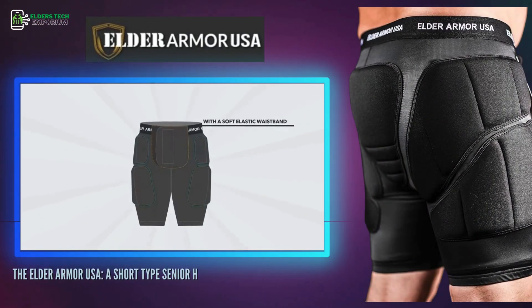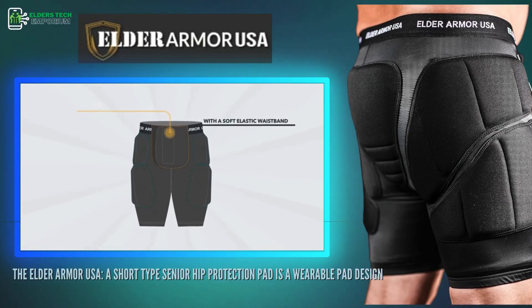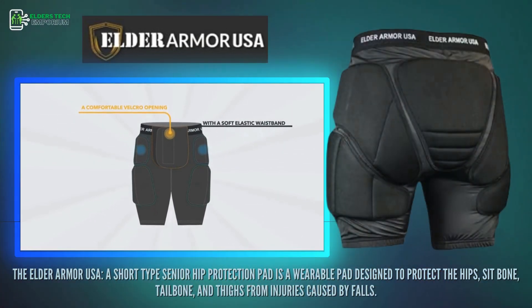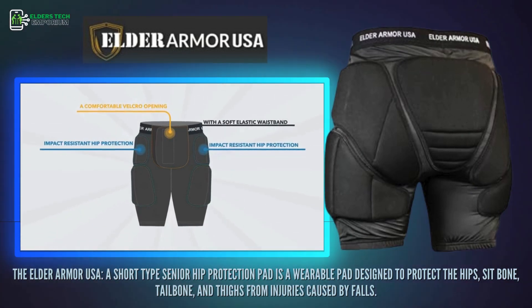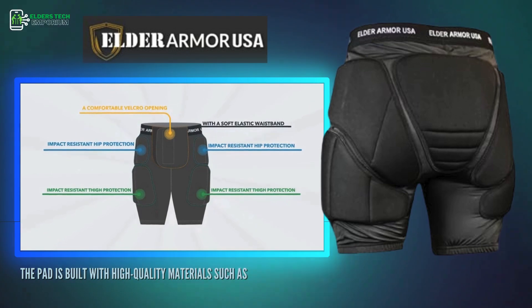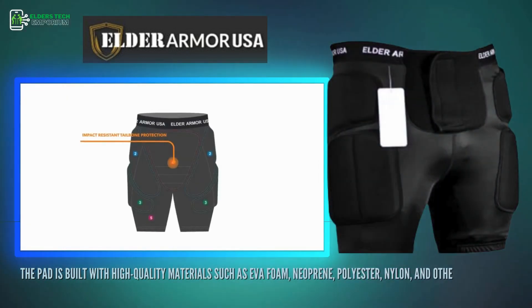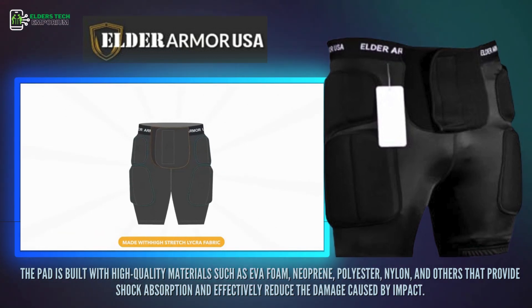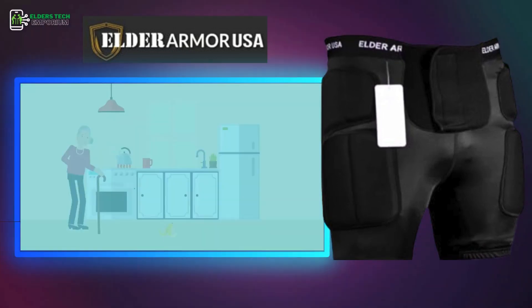The Elder Armor USA, a short type senior hip protection pad, is a wearable pad designed to protect the hips, sit bone, tailbone and thighs from injuries caused by falls. The pad is built with high quality materials such as EVA foam, neoprene, polyester, nylon and others that provide shock absorption and effectively reduce the damage caused by impact.